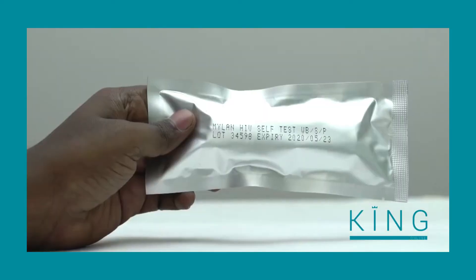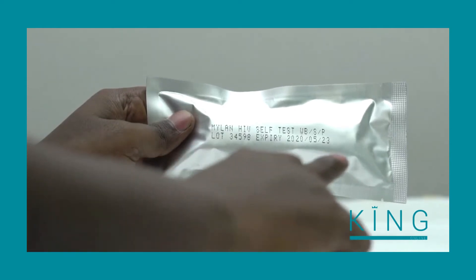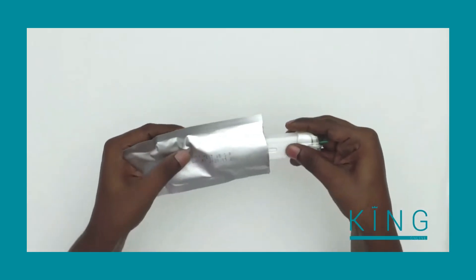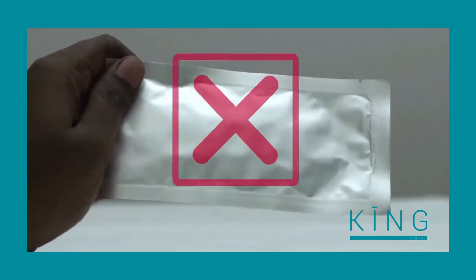Before you open the foil pouch, check the expiration date to make sure it is still current. Open the foil pouch using the tear notch and take out the test. Do not use the test if the foil pouch is damaged.